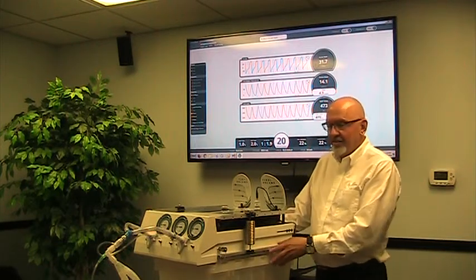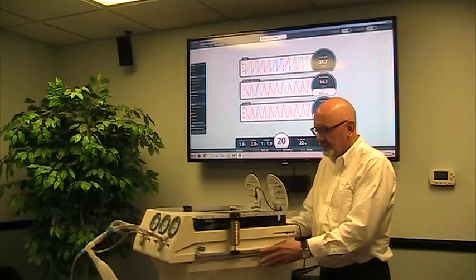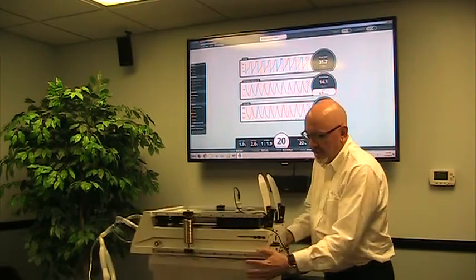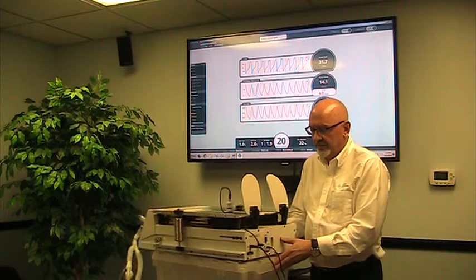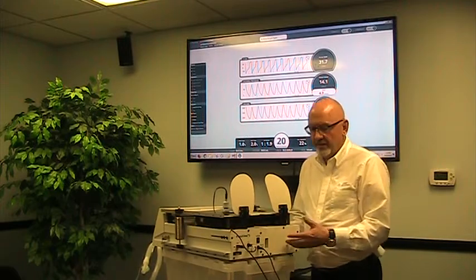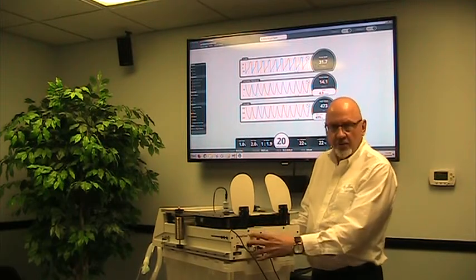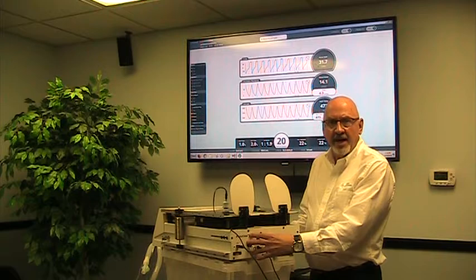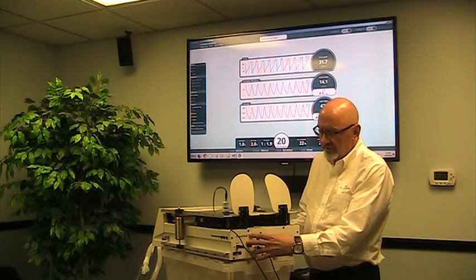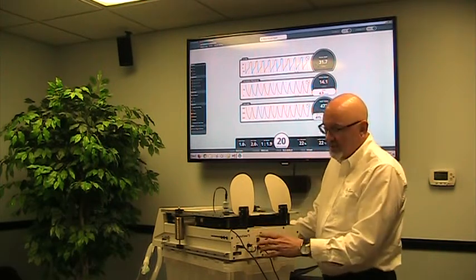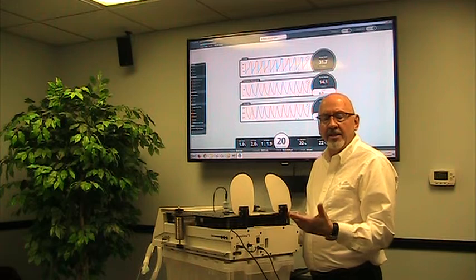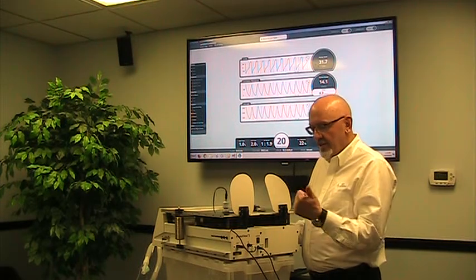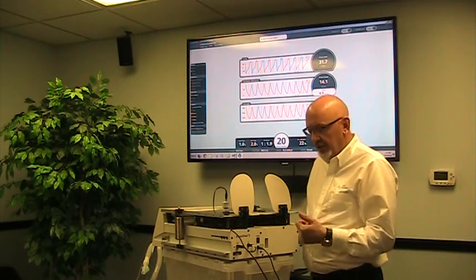The other thing that's on a NuView system is the electronics module. Now every NuView system has an electronics module embedded in the body of the test lung and in that electronics module we are measuring pressures. We also measure oxygen and we measure temperature.